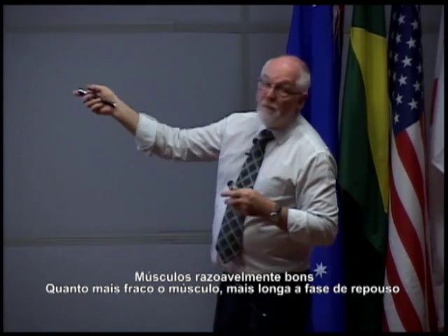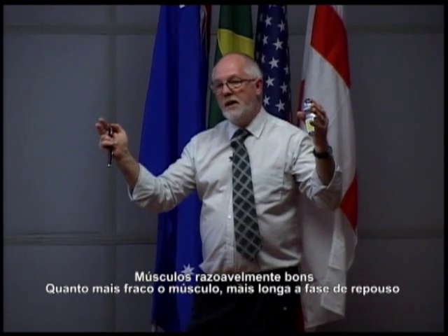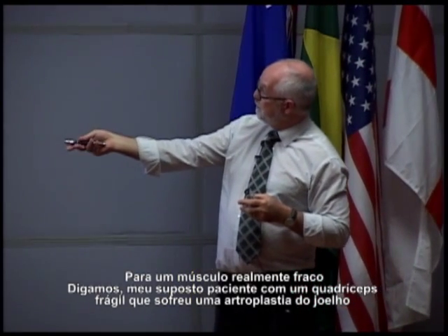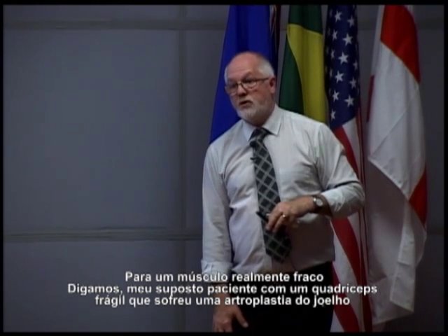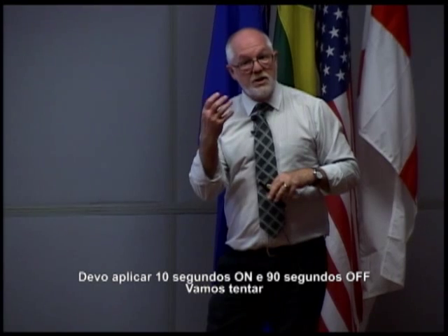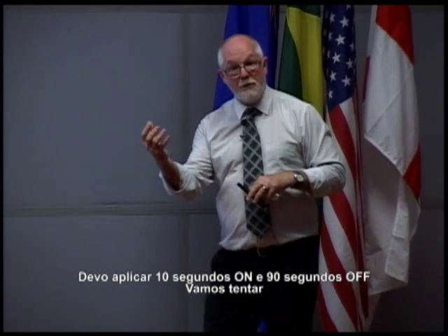The weaker the muscle is, the longer you leave your rest phase. So for a really weak muscle, let's say my pretend patient with the weak quadriceps who's had a knee replacement, I might do 10 seconds on and 90 seconds off.